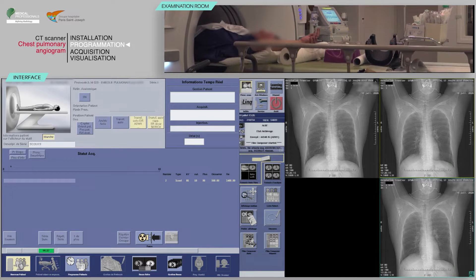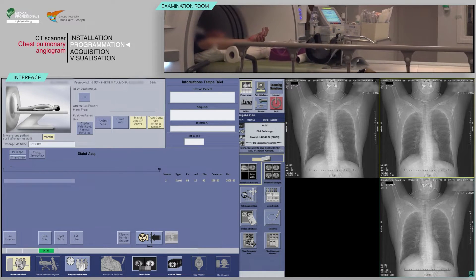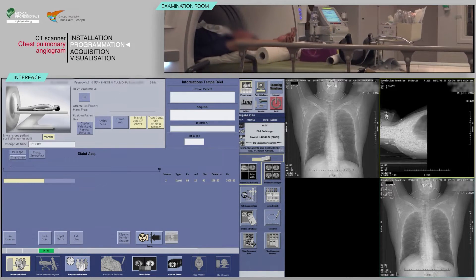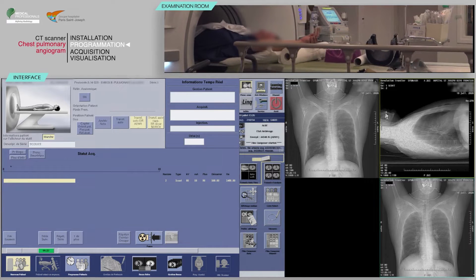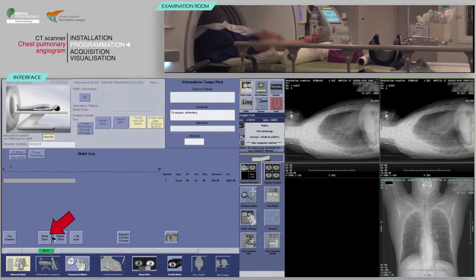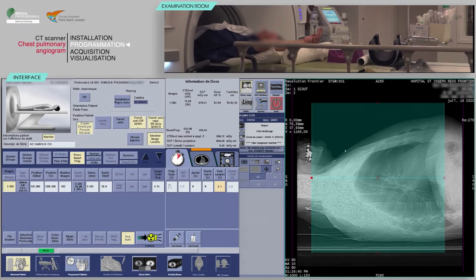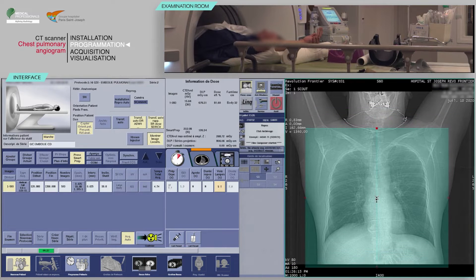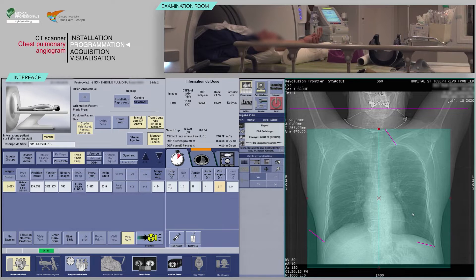Repeat to obtain a lateral view. Click Next Series. Place your slices box on the AP localizer in such a way as to cover the lung apices to the lateral costophrenic angles.